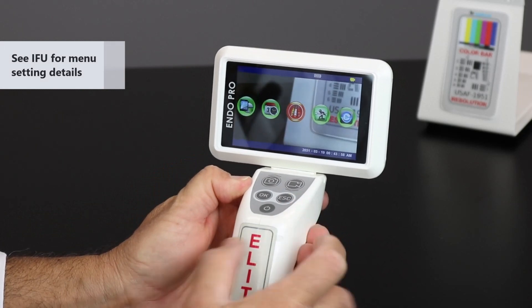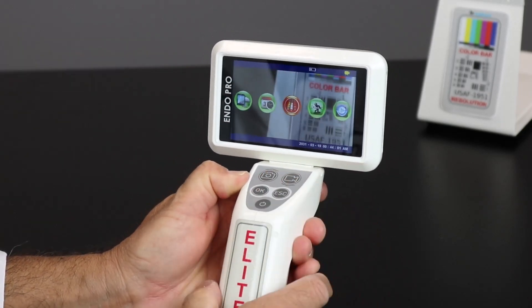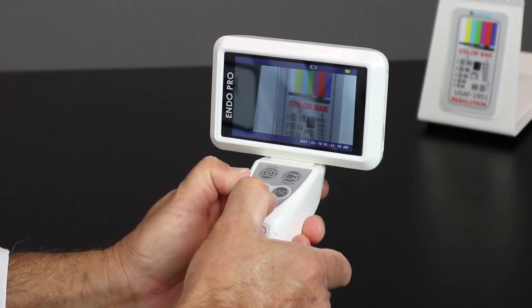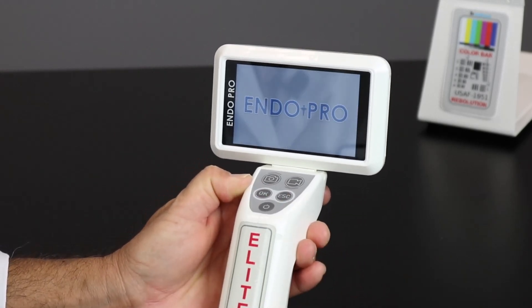You can also escape the menu by clicking escape. And then to turn off the unit, you simply hold down the power button to turn off.